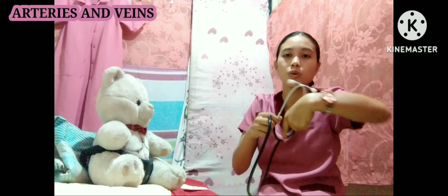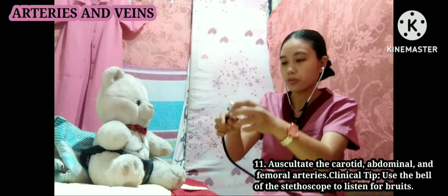Then I'm going to listen over the carotid artery, listening for a bruit, which is a swishing sound. I'm going to be listening using the bell of my stethoscope here. That would be a low pitch sound. So I'll place my stethoscope about halfway down the neck.